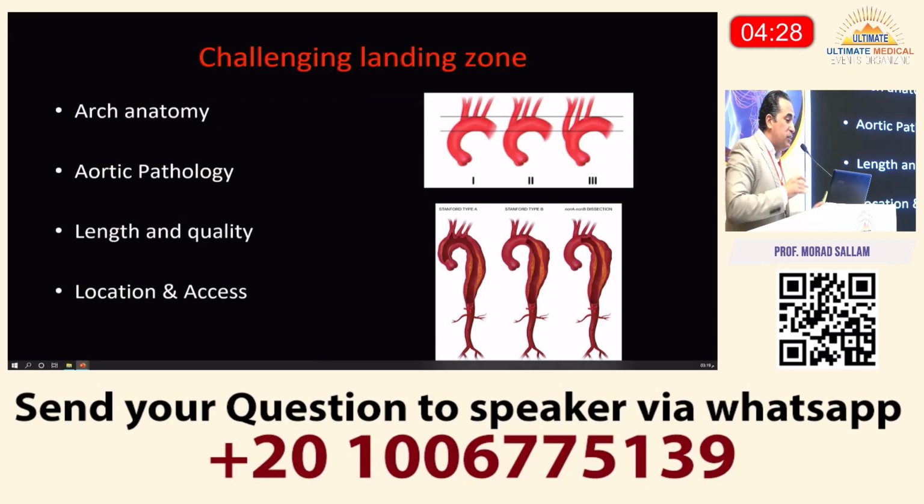And moving on. Challenging landing zone. I would move here to the challenging landing zone and highlight that arch anatomy can make it very difficult. The different types of arch, how steep it is, is one of the most important challenges. Then the aortic pathology, whether it is a dissection, a very friable, hostile aorta, or an aneurysmal disease full of plaque in the arch. This is another type of challenge. The length and the quality, which we talk about most, is mainly designed for aneurysmal disease, the 2 centimeter parallel walls of the aorta. And finally, the location. Where exactly are you landing? Are you landing in zone 1, 2, or 3, or maybe zone 0? And the access sometimes restricts and makes even your landing zone a little bit difficult.